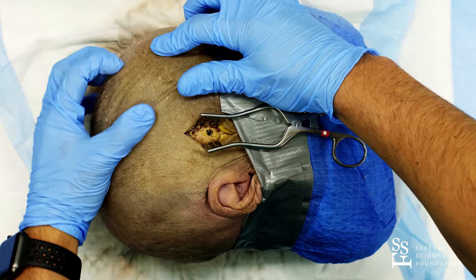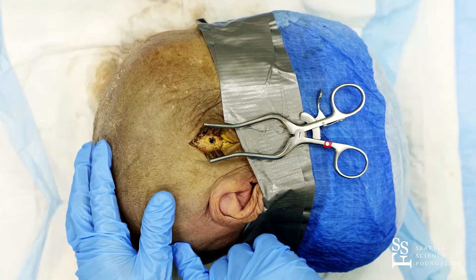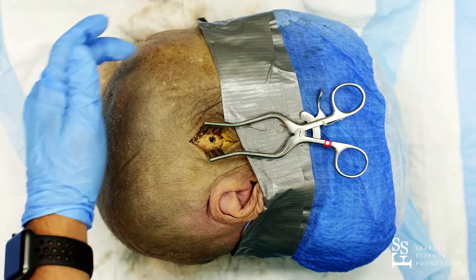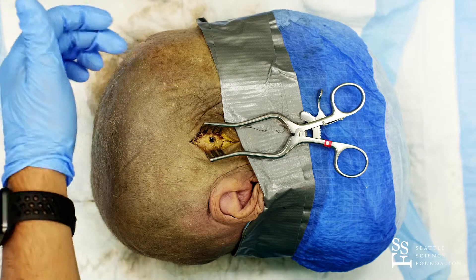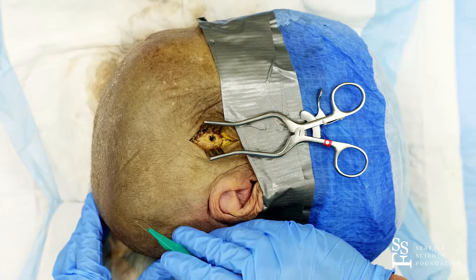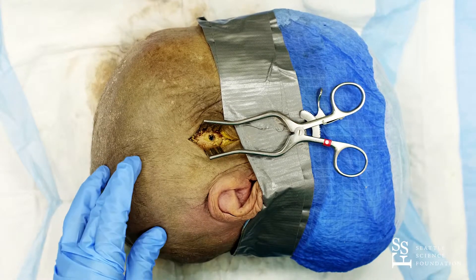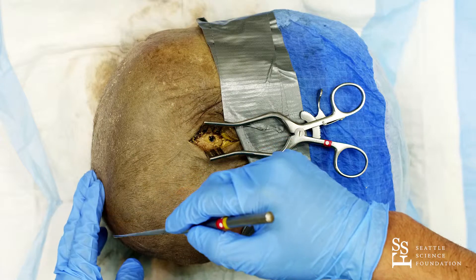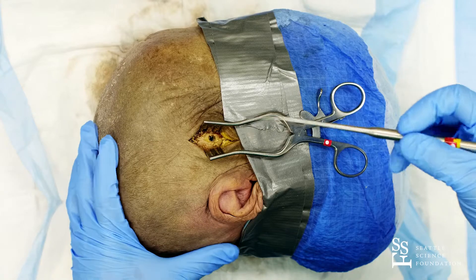In a normal person, you can palpate the coronal suture as a depression over the frontal bone. The third burr hole, if you don't find any bleeding or hematoma at any of these sites, will be a parietal one right over the convexity. So in total you will have the temporal, frontal, and parietal burr holes, and also the contralateral temporal one.